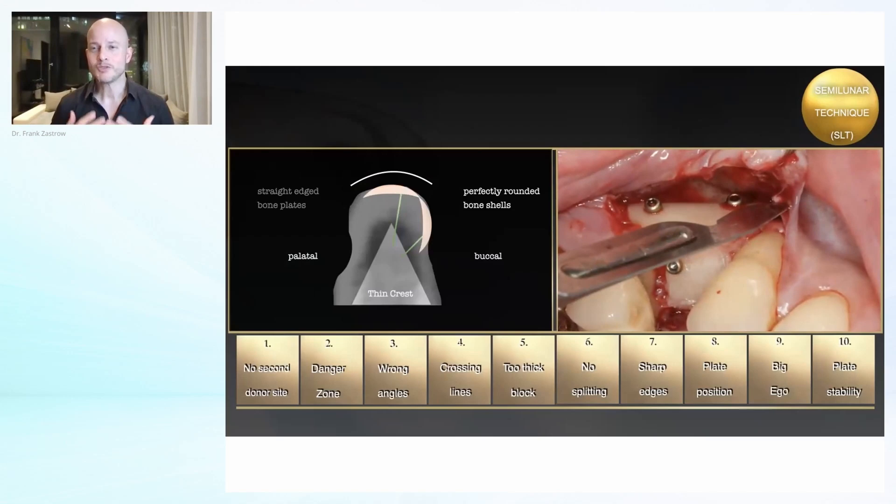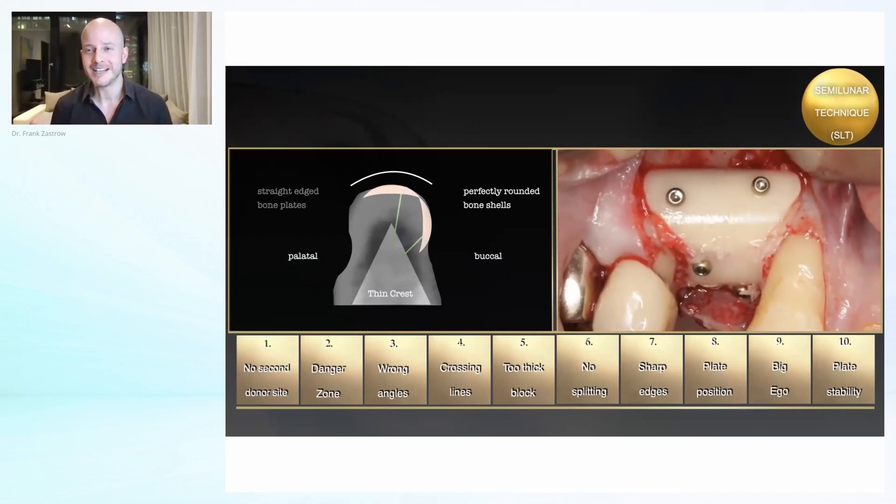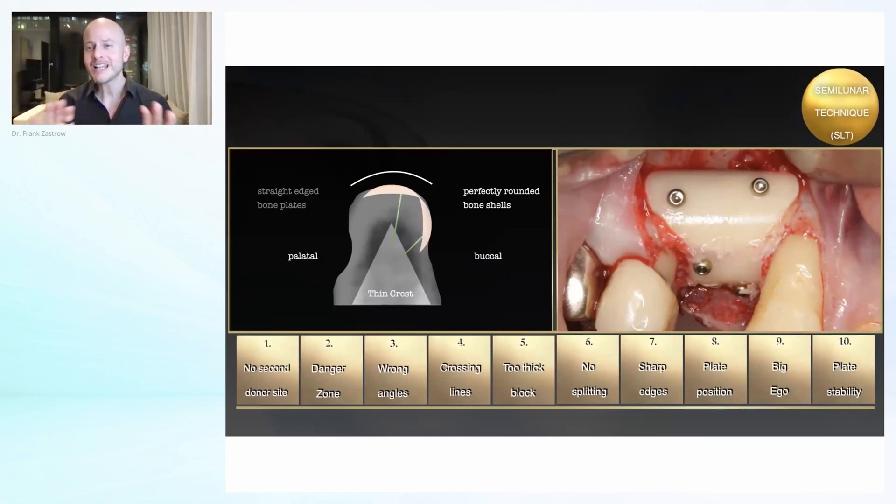Sorry if I seem so fascinated by that, but if I as the inventor wouldn't be excited about it, who else would be? I really like how you can see the light reflection even on the bone. When I first shared these cases, nobody believed me this was autogenous bone because it looks kind of artificial. But now you know how we get it — they are collected with the Trayfine. The nice thing is that most of the mistakes you can make with other techniques cannot be made when using the semilunar technique.